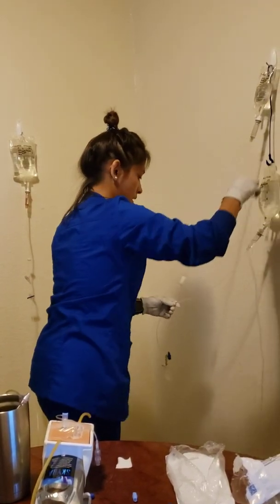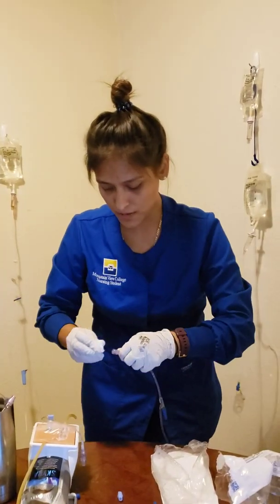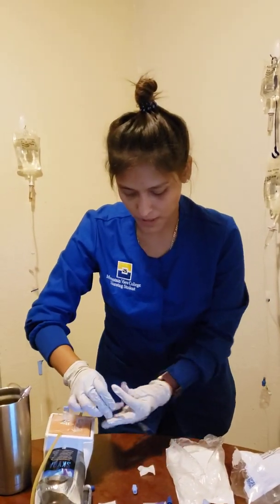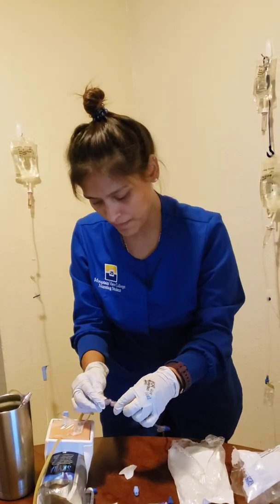And then I'm gonna come here and everything is primed. So I'm going to go ahead and actually connect this to Miss Chi. I've already flushed it, so it's okay for me to put it on. So everything is clean with that brand new alcohol.